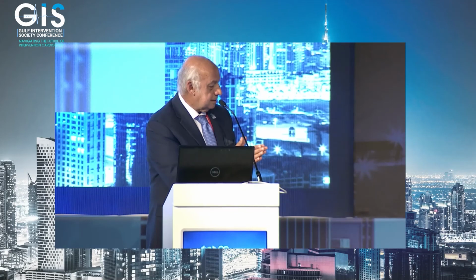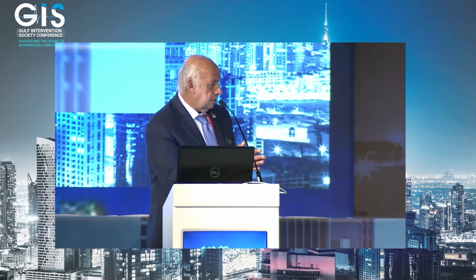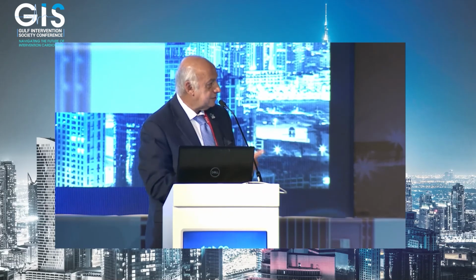The stent thickness now, I think it's very important. We don't see stent thrombosis, for example, as in the old ones. And if you do a POT, it will be more or less resilient to open the struts in order to make it easy to reach the side branch. When I use the second generation now, I find it easy to cross into the side branch. So I agree with what you say.